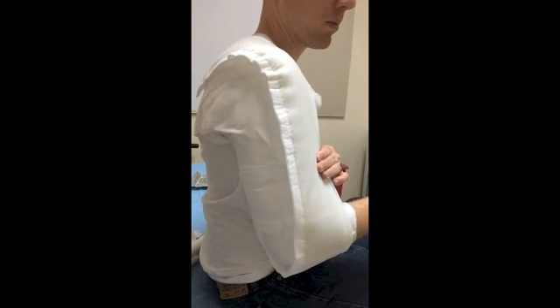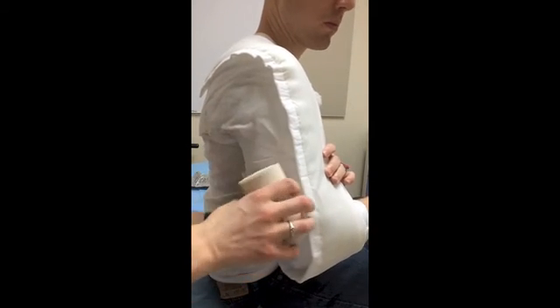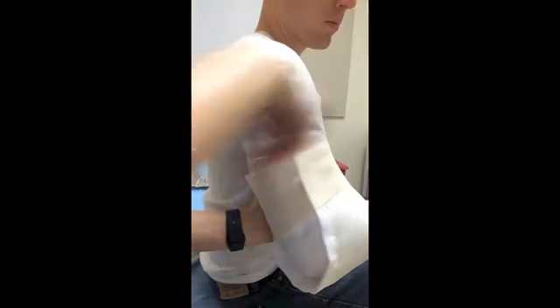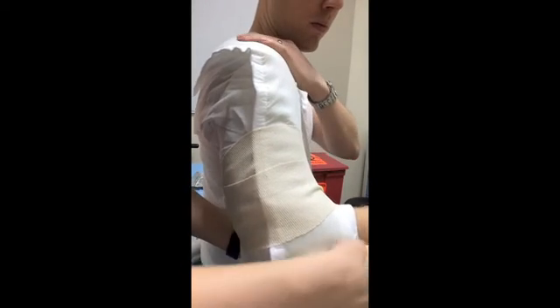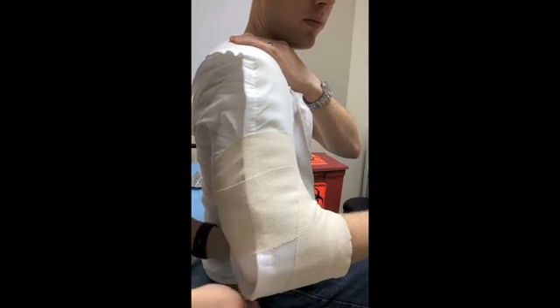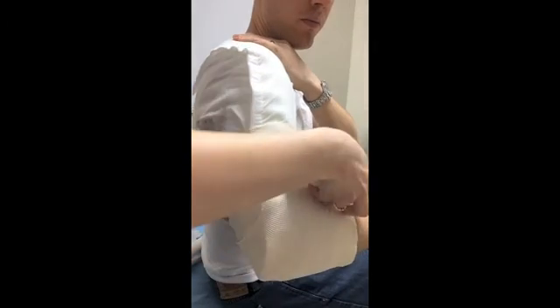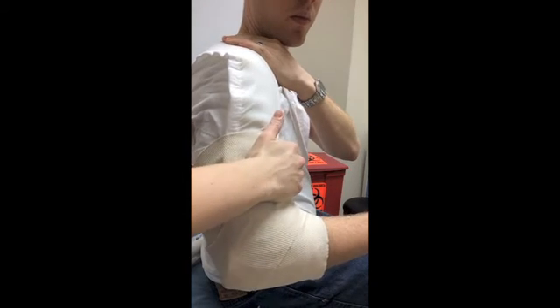While that dries, we can start securing down low. We've got our bias. Kind of just wrap that underneath to keep this splint material in place. We'll come down and capture the elbow, a little bit of that forearm. Coming back down and around.